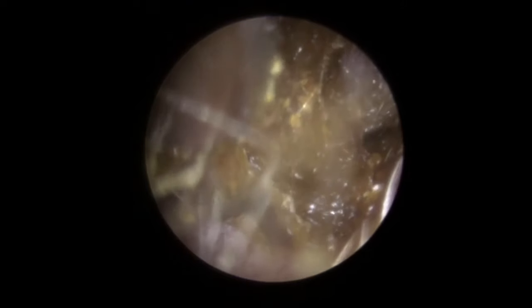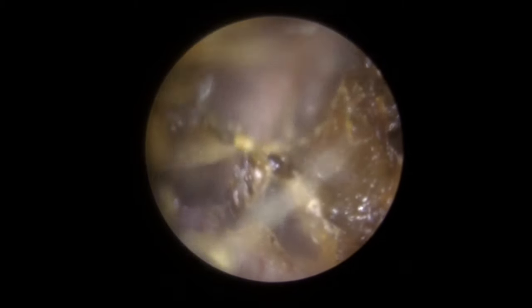As we fold it into the centre now — what I'm aiming to do, if I can get rid of this left-hand piece first. If I try and pull the centre section away with this left piece still attached, the wax is just not going to go anywhere. So if we can free up that section first, it really makes a big difference when we come to get that central section away. There we are — we've managed to peel a nice big chunk away from the left-hand canal wall. You can see some of that got suctioned in, so we're going to go back in and grab the remainder.